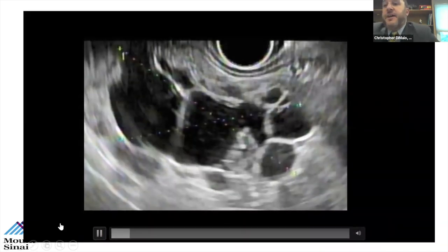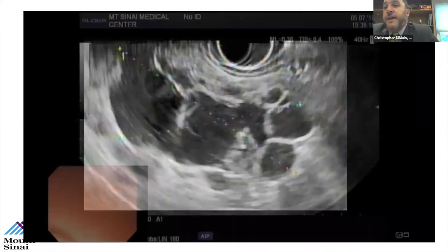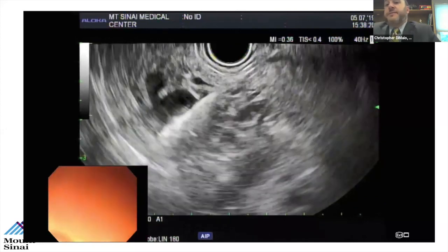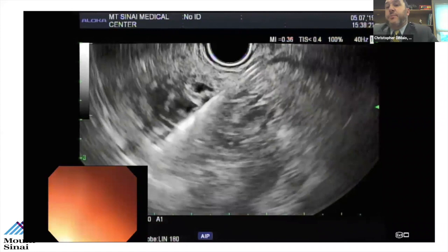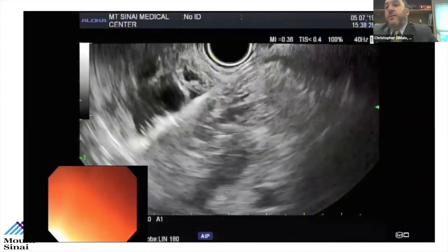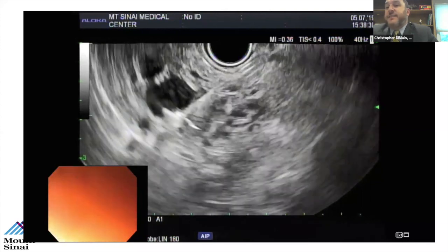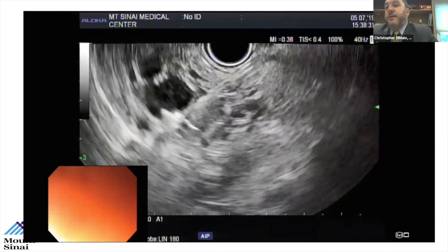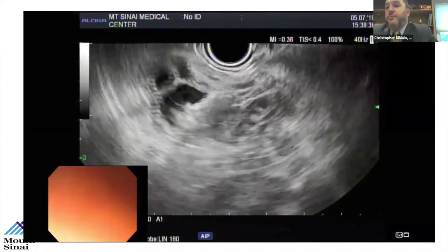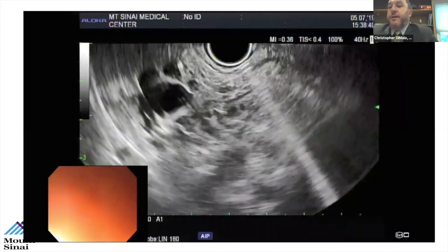Here's just the still shot of this lesion. So again, we have a 19 gauge needle preloaded with our biopsy forceps. I apologize, it's a little bit blurry. But here you see that we're able to grab the tissue and really tent up that cyst wall. We have to actually pull quite hard. Sometimes you need your assistant to pull that forceps out for you. But it's just an example of how these forceps are really nice at grabbing a good amount of tissue.